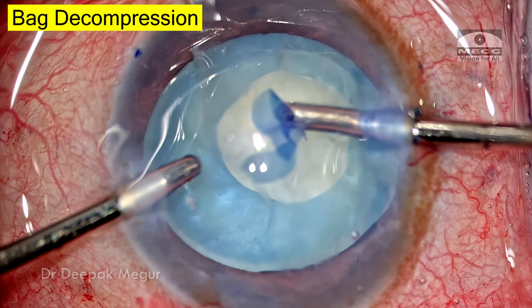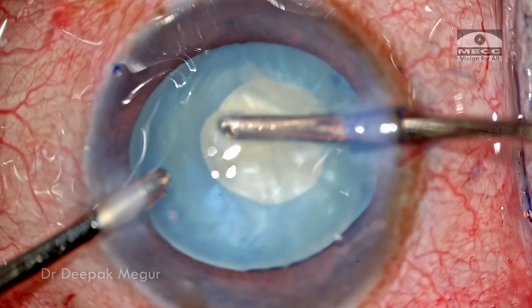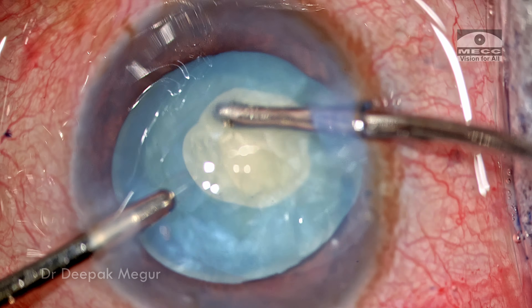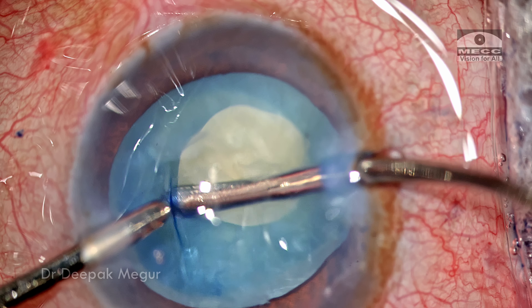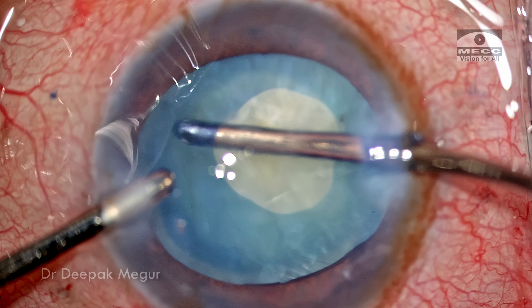Time to decompress the lens. I'm going to use bimanual I&A to decompress the bag. The irrigation is held in the anterior chamber itself, whereas the aspiration cannula goes into the capsule bag and teases out all the superficial swollen cortex and the epinucleus.